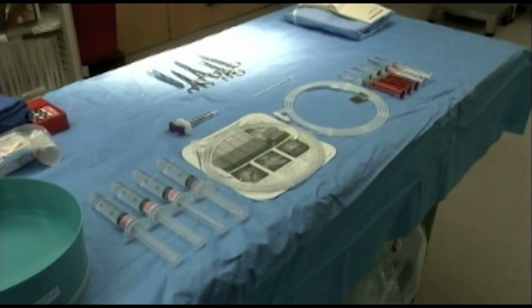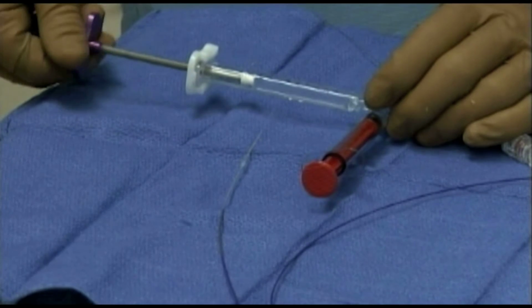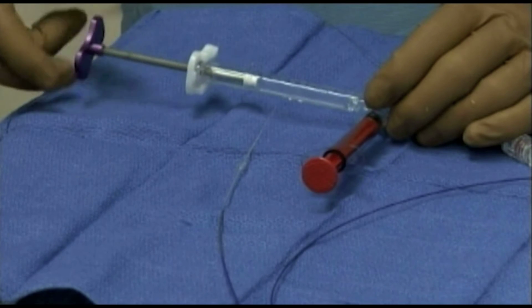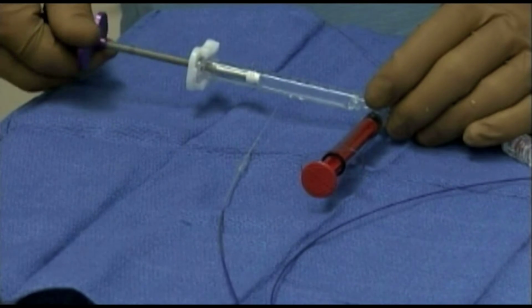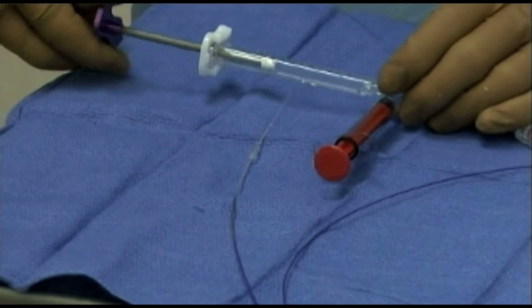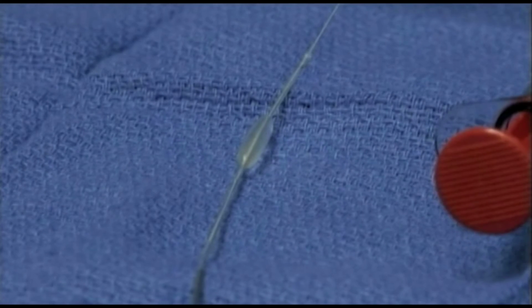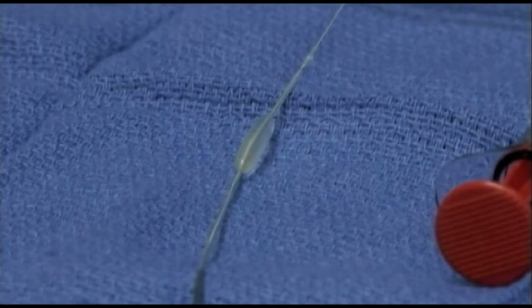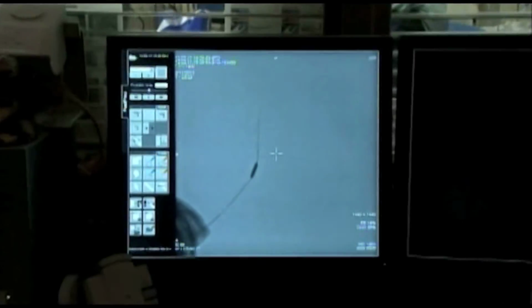Balloon angioplasty has been shown to increase lumen caliber, improve cerebral blood flow, and reduce the incidence of delayed cerebral ischemia. Due to the risk of vessel rupture, we reserve the use of balloon angioplasty for larger proximal arteries. A Cadence syringe is used to inflate the balloon since the syringe provides a very precise measurement of volume introduced into the balloon. In order to ensure visibility of the balloon during the procedure, we first test the balloon with inflation outside of the body and place it under fluoroscopy to evaluate contrast opacity.